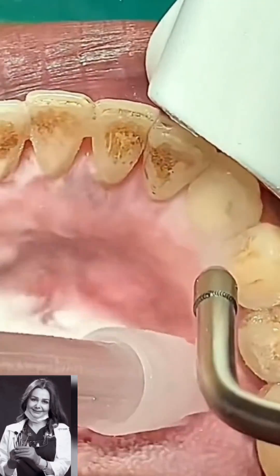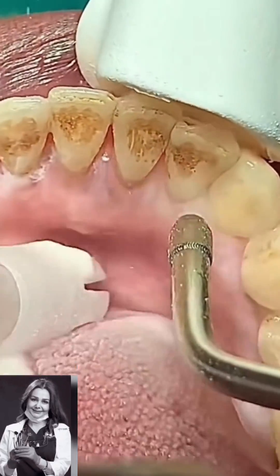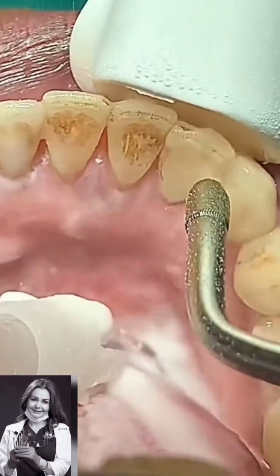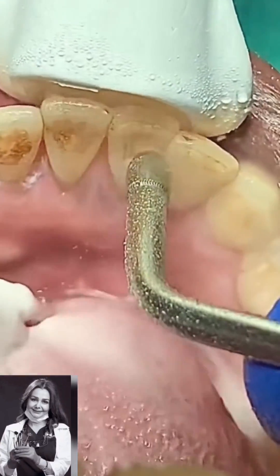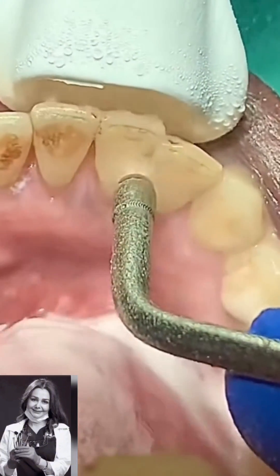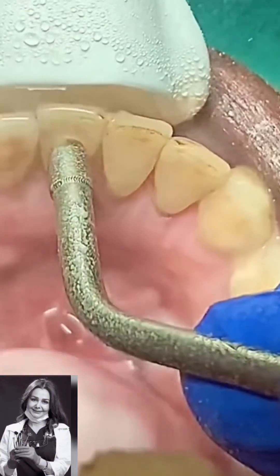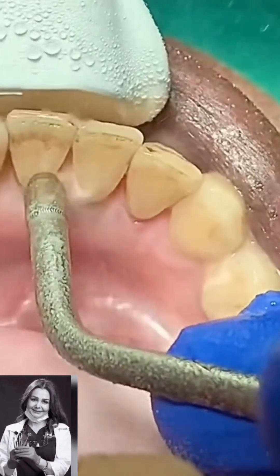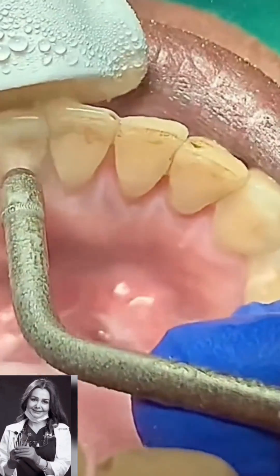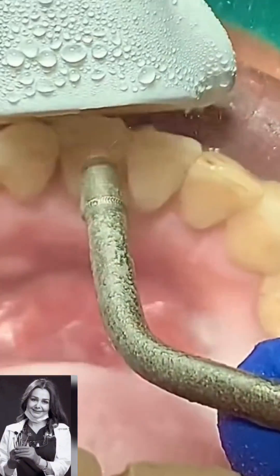Teeth sandblasting is a standard and simple dental procedure performed to improve oral hygiene. It involves cleaning teeth from scale and sediment with a high-pressure suspension containing particles of a cleaning substance. The granules added to the liquid are called dental sand, hence the name of the whole procedure.